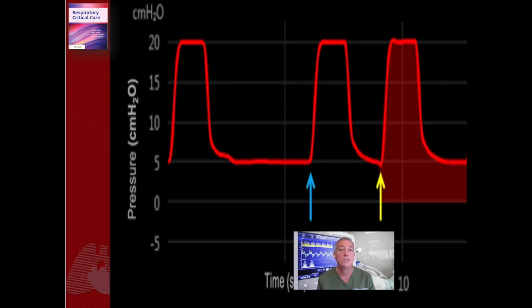When somebody asks how do you know the patient is not breathing even though the ventilator is saying so, it is the absence of that negative dip, or negative deflection, that indicates auto trigger. So not only a fast rate, but when you analyze the pressure tracing for those breaths, there is an absence of the negative deflection that is very characteristic of the patient-initiated breath.